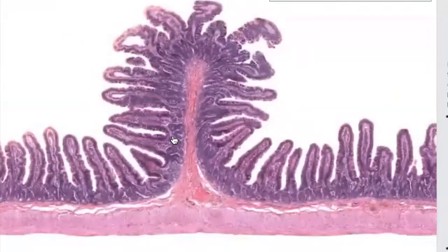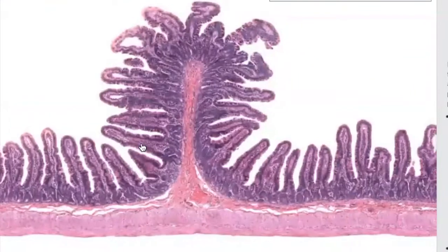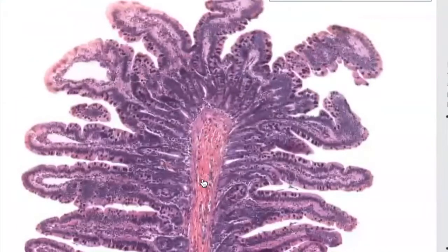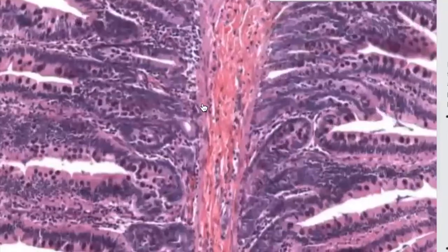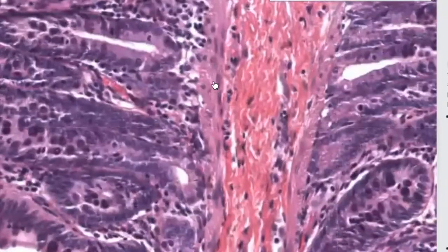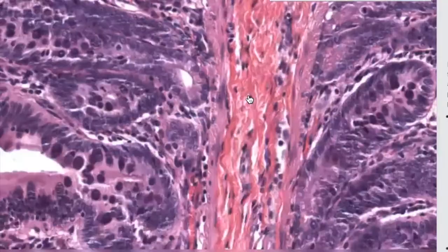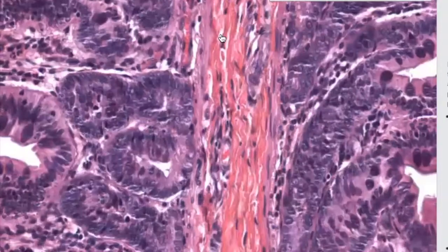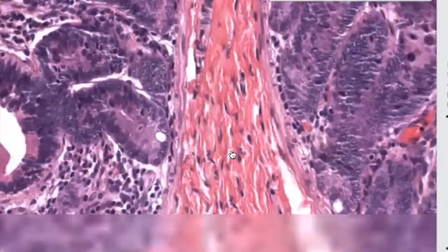Yeah, I showed it in my video, on my slides, right? So over here are the villi, right? This is the circular fold that's going to include the submucosa up here. Again, the muscularis mucosa is that thin lining up here, and then you get the transition into the submucosa, right? Over here is all the mucosal layer lined by the simple columnar epithelia.